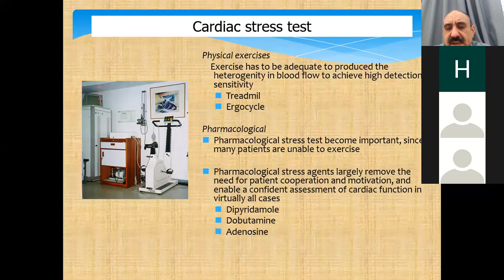The other pharmacological agents don't increase the heart rate, but they can cause vasodilatation, and they can cause side effects like abdominal pain or epigastric pain. And we usually advise the patient not to drink tea or coffee for 24 hours before the procedure.